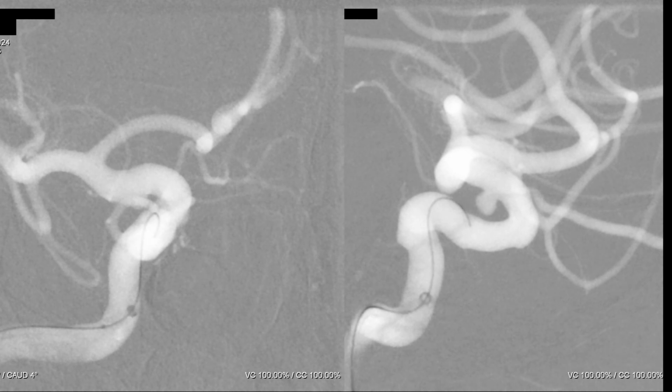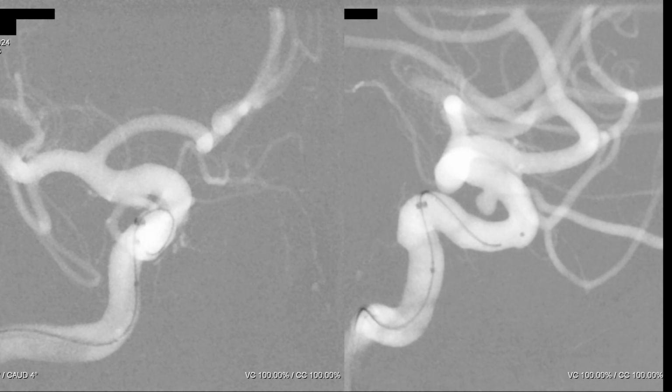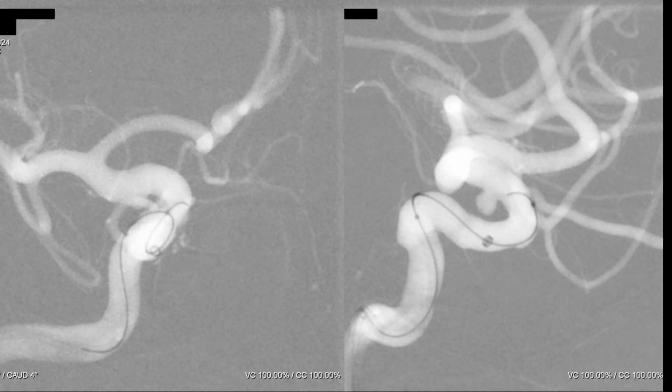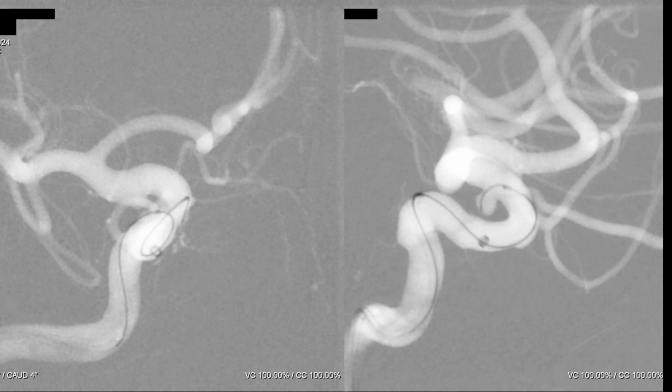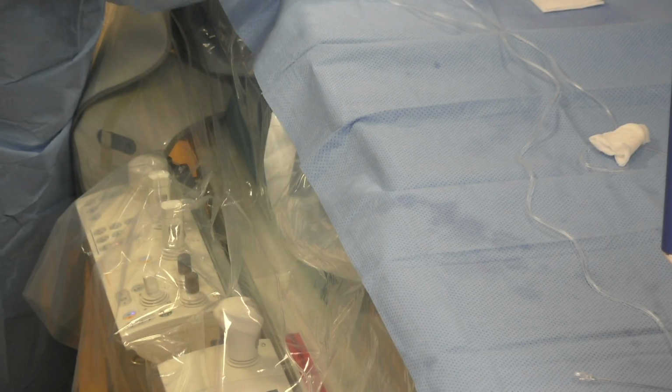We're navigating here with the microwire, and this is the microcatheter. Now we can push the intermediate catheter a little bit distally, and we're navigating the sac of the aneurysm with the microwire, and now we're pushing the microcatheter in the aneurysm sac.